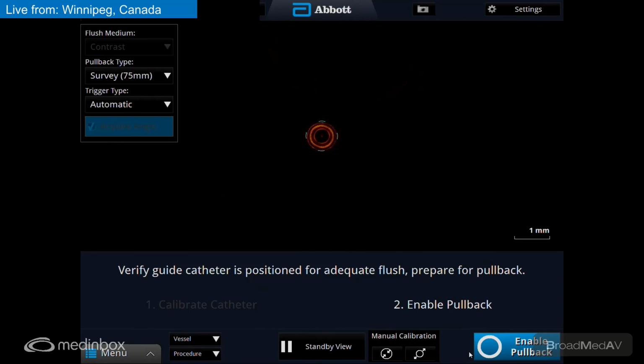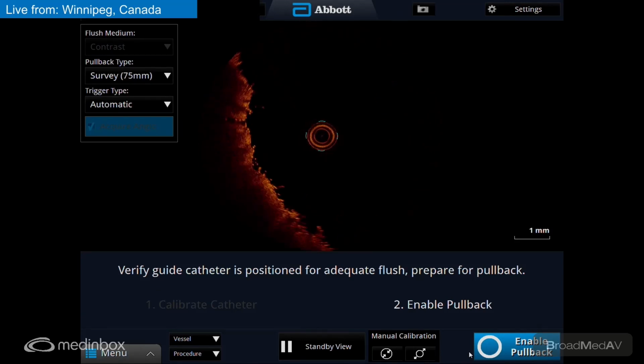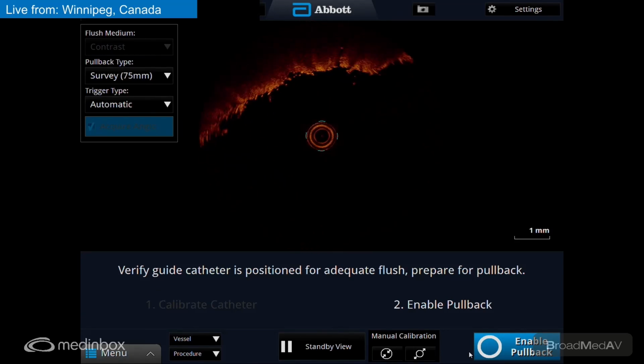I think you take a big balloon here, take the 3.5 back in. Yep. Let's get the 3.5 NC back. Do we have a 3.5 NC? Should we get a short one and just trap it distally? Because I don't want to balloon it distally. That's a good point. Yeah.